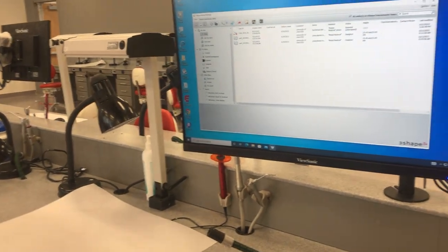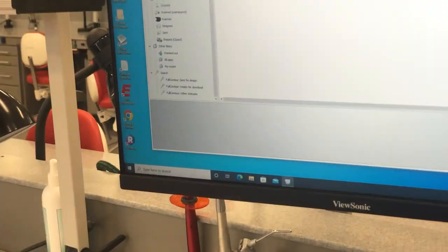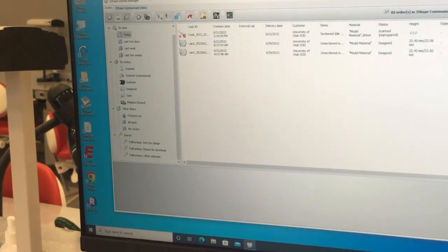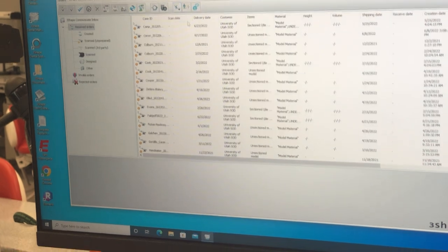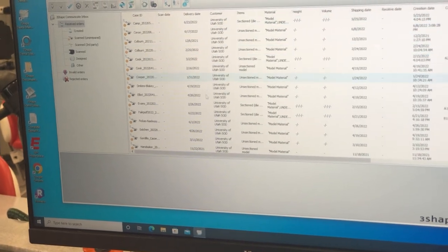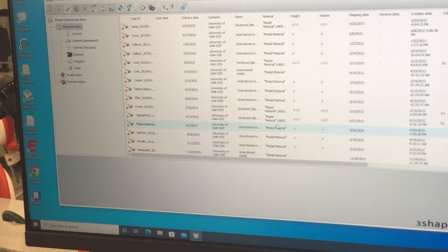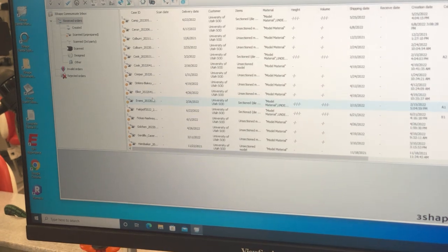Now because this is a lab system, we've sent it over from our 3Shape machine and you've got to click on this 3Shape Communicate Inbox. These are all the files that have been sent to our lab from the 3Shape machine.